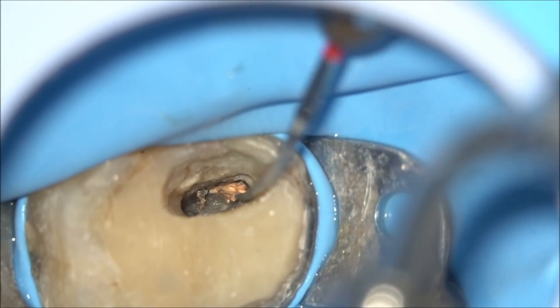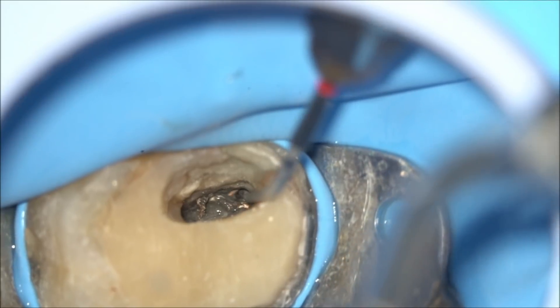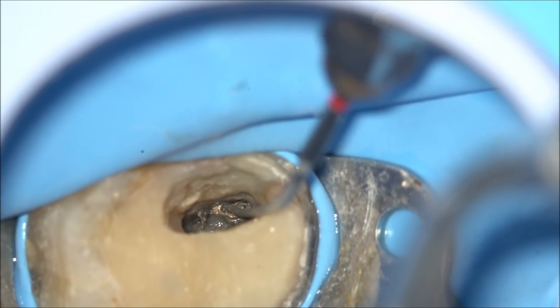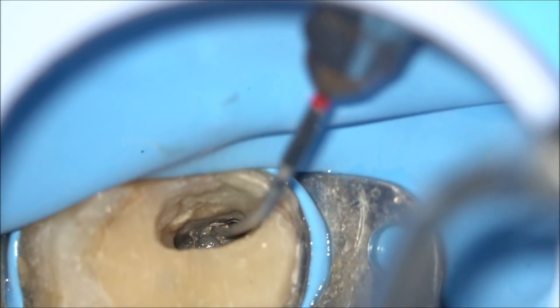The endosonic files have the ability to soften the Gutta Percha mass and create an initial glide path for my re-treatment files to go inside the canal. Whenever we start a re-treatment case and remove the core, there is hardened Gutta Percha with hardened sealer. Sometimes it is difficult to directly instrument the canal with rotary files. The ultrasonic files generate heat, soften the Gutta Percha, and make passage of the re-treatment files inside the canal much easier.